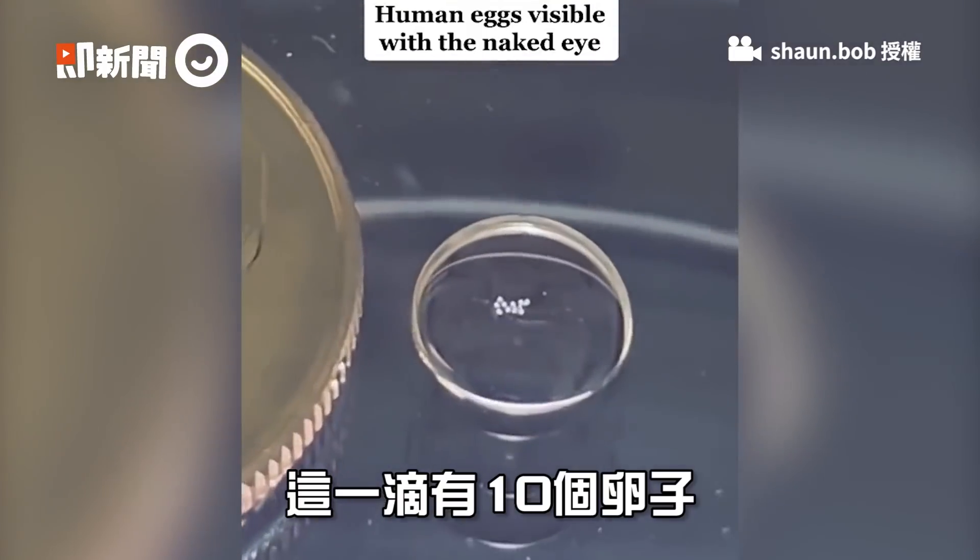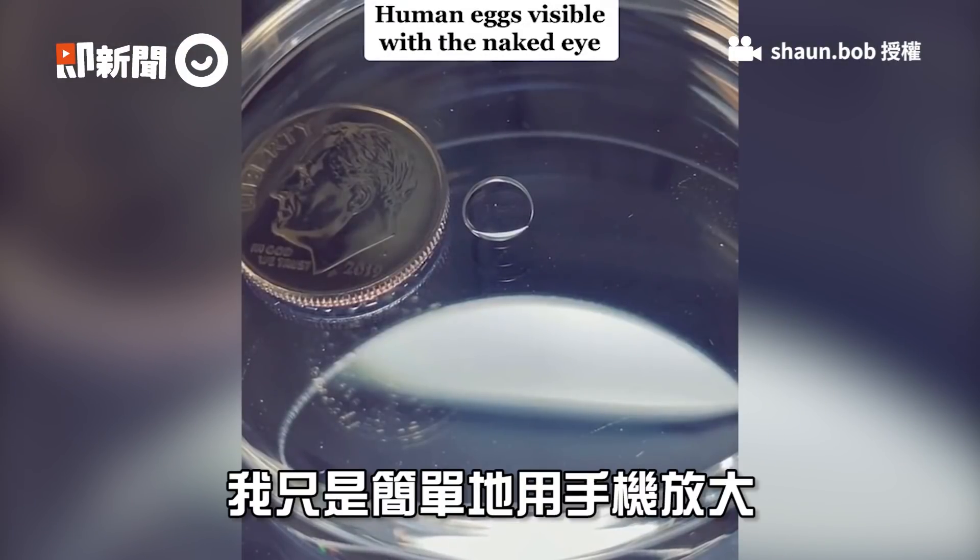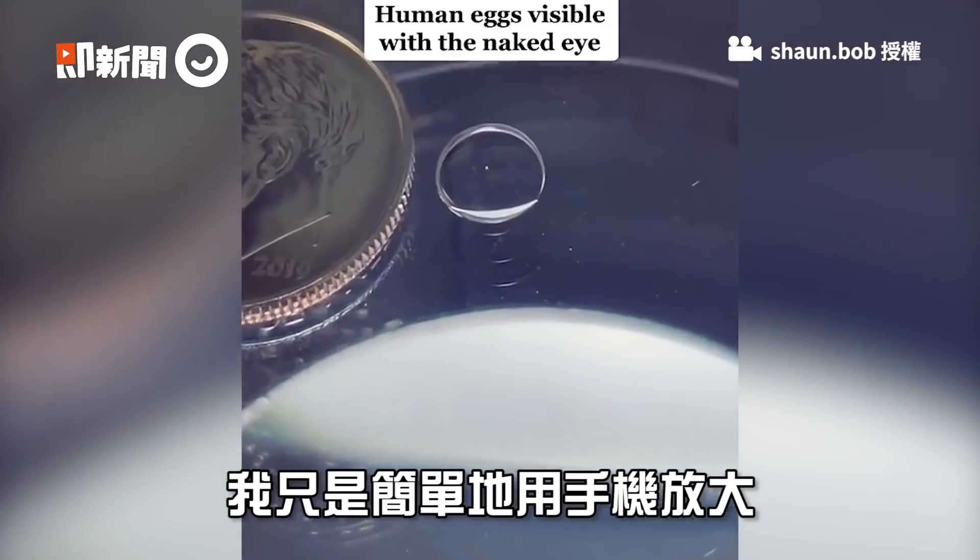This first drop has 10 eggs in it, and this one has one. That's just my phone being held close to the dish before zooming in.